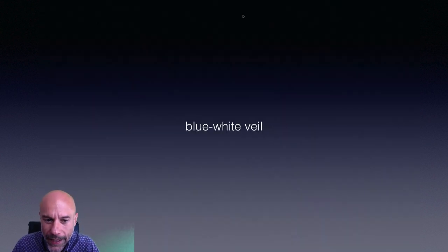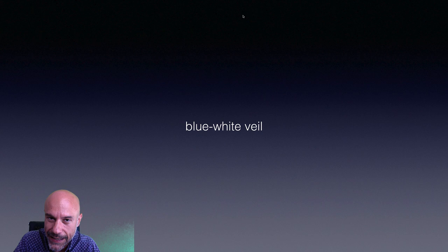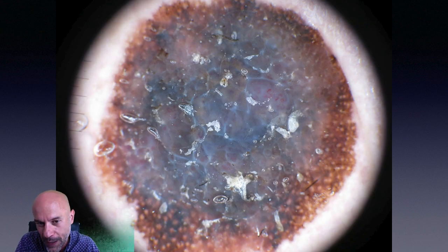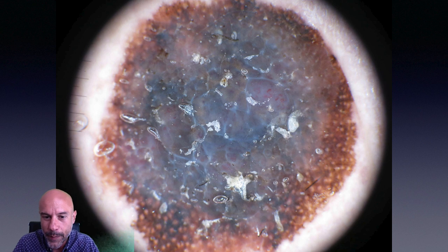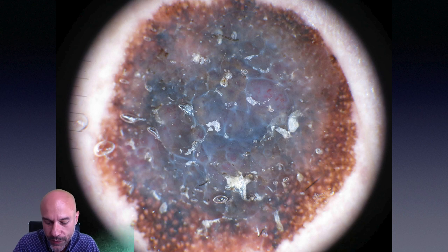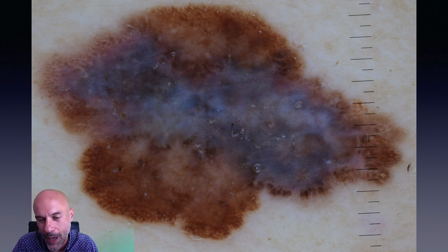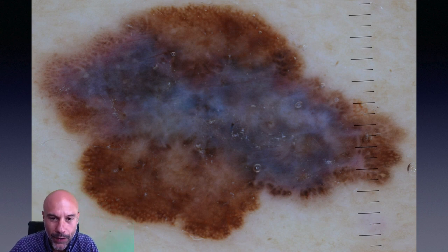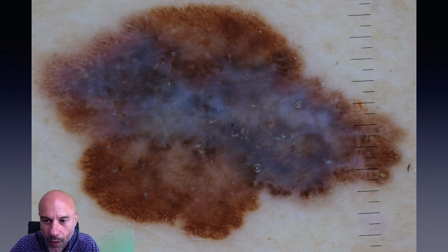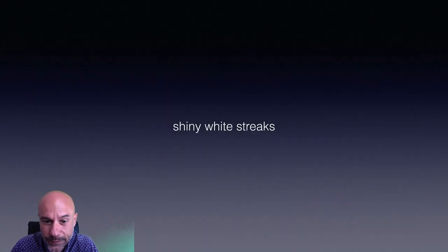A few more melanoma criteria are easy to recognize because they are mainly seen in advanced melanoma. The so-called blue-white veil — this combination of blue and white translucent color — is of course highly suspicious for melanoma. Here is one more example; it is quite straightforward to our eyes, and it corresponds to advanced melanoma, as blue color means there are melanocytes deep in the dermis.